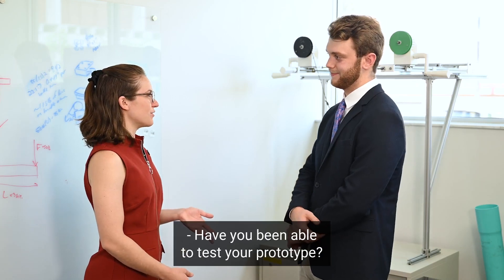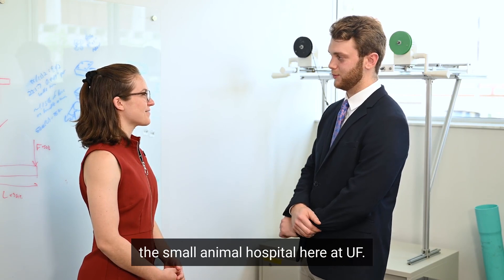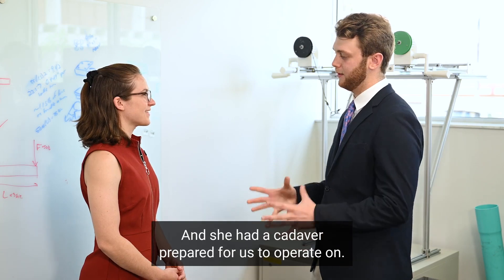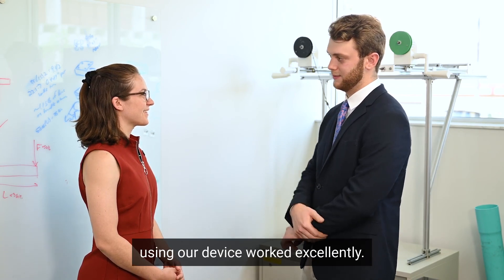Have you been able to test your prototype? On August 2nd, we went to the small animal hospital here at UF, met with our client, the veterinarian, and she had a cadaver prepared for us to operate on. All the procedures that she did using our device worked excellently.